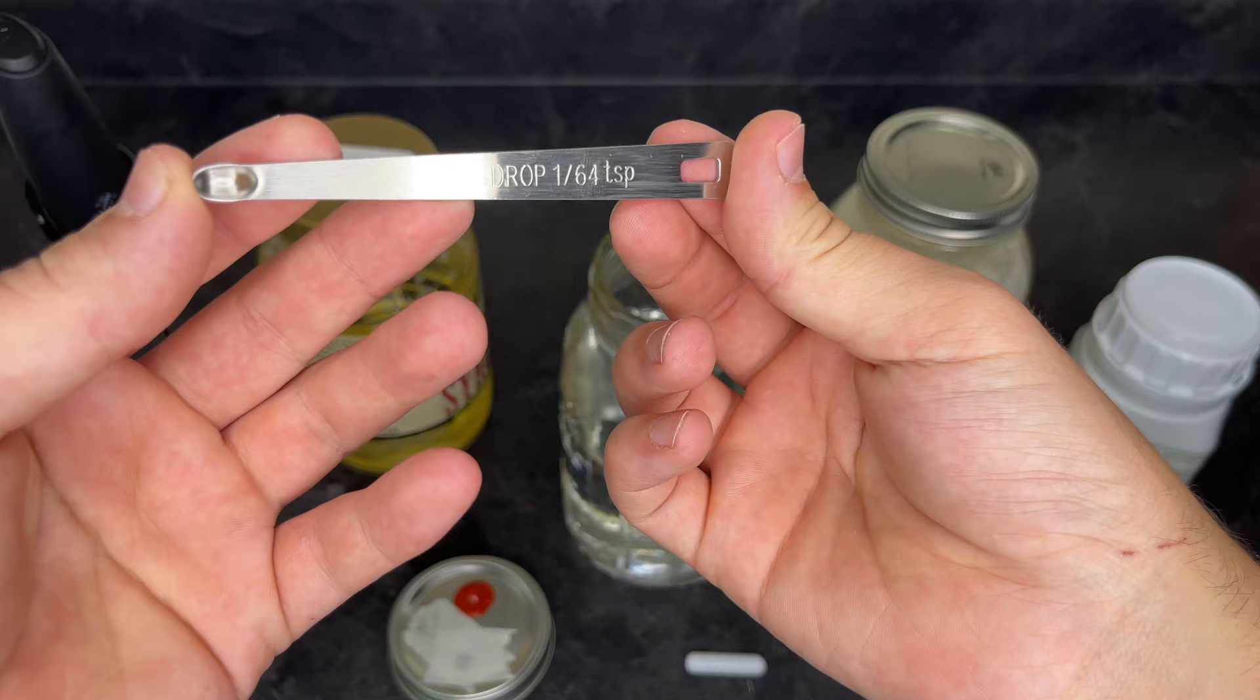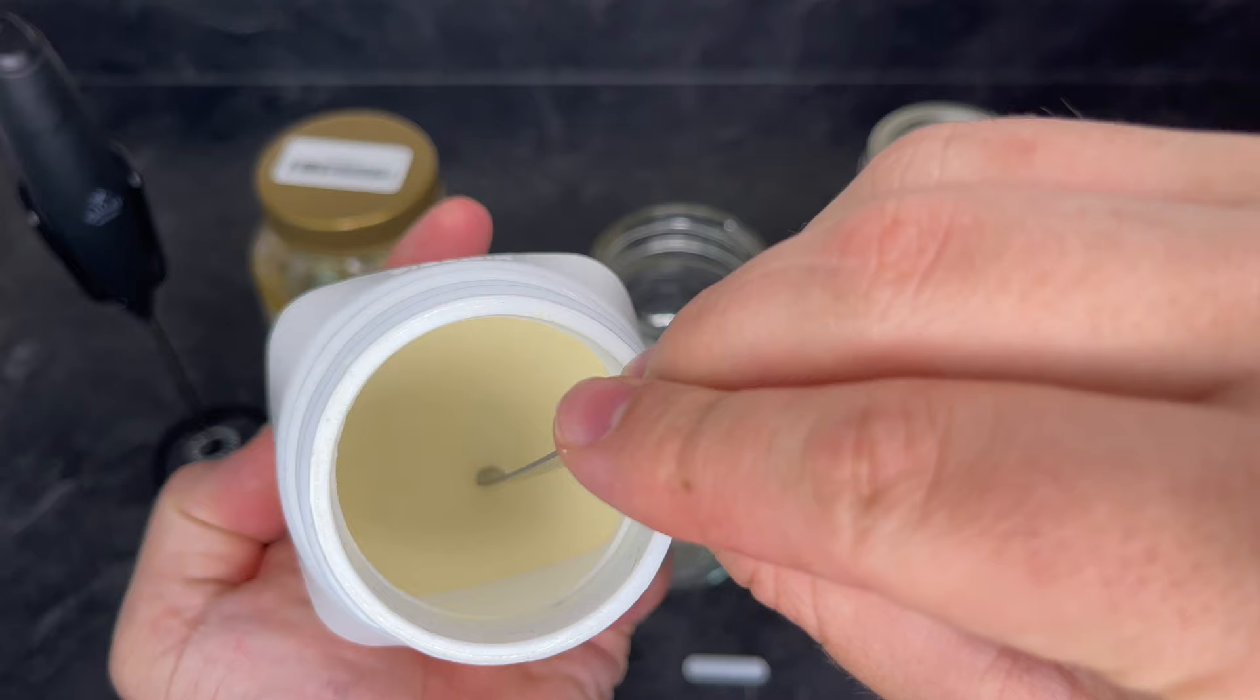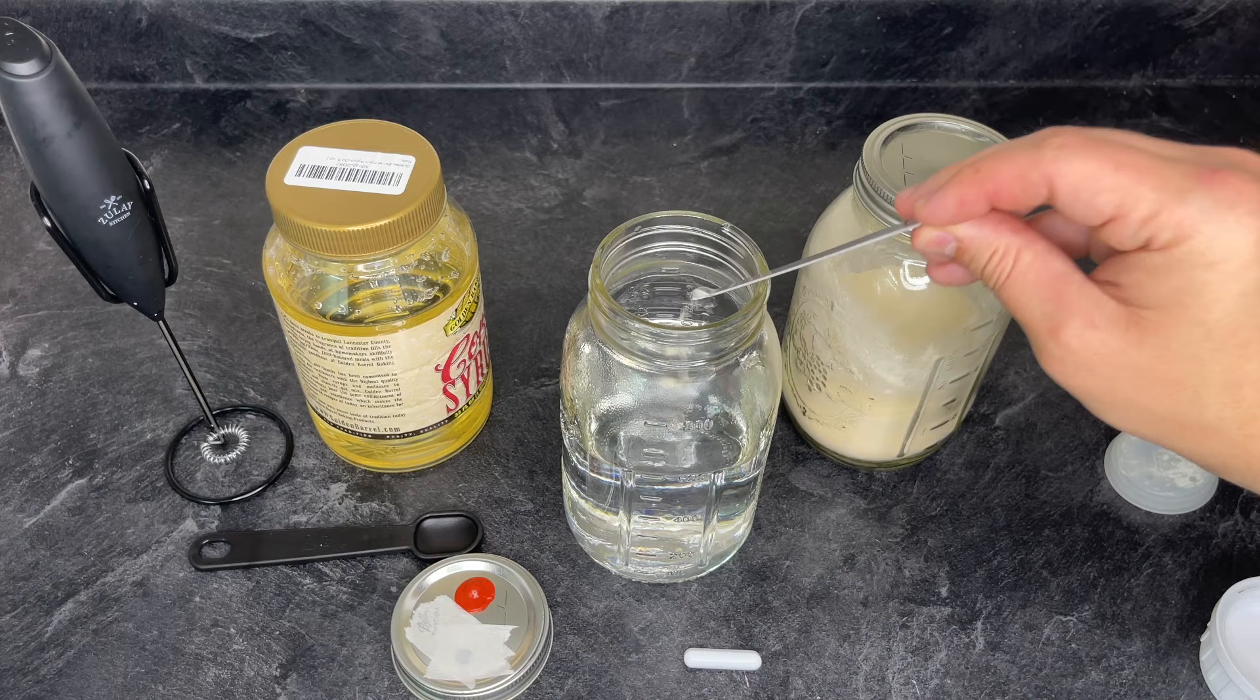I only use 1/4 teaspoon for each ingredient because if I used more, the solution would become cloudy and the mycelium does not grow as fast. You're welcome to try experimenting with adding more, but it just doesn't seem to dissolve well enough without an expensive hot plate.